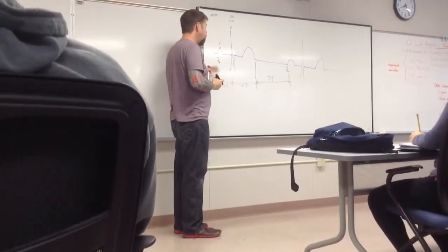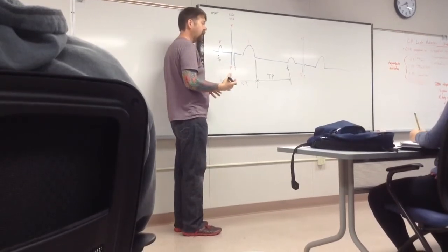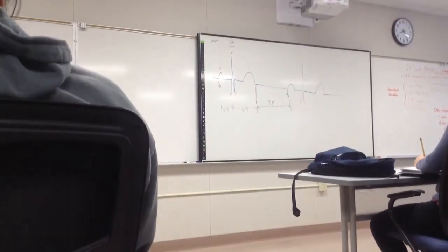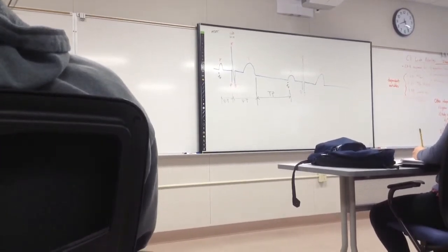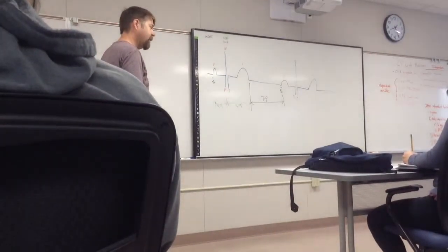Okay. So to do this, we need to do an EKG tracing on the test subject immediately after exercise, immediately after biofeedback, immediately after standing up from lying down, to get an idea of, if the heart rate changes, how did the EKG change? And that gives us an idea of the mechanism by which the heart rate increased. Was it just sympathetic or parasympathetic stimulation? Or did something happen within the tracing to facilitate that? Does that kind of make sense?